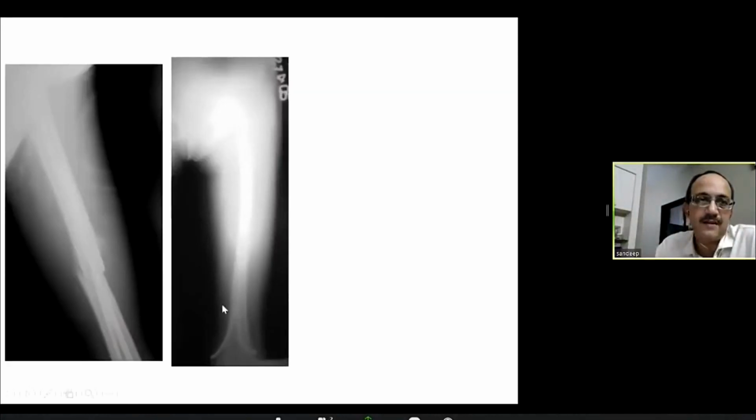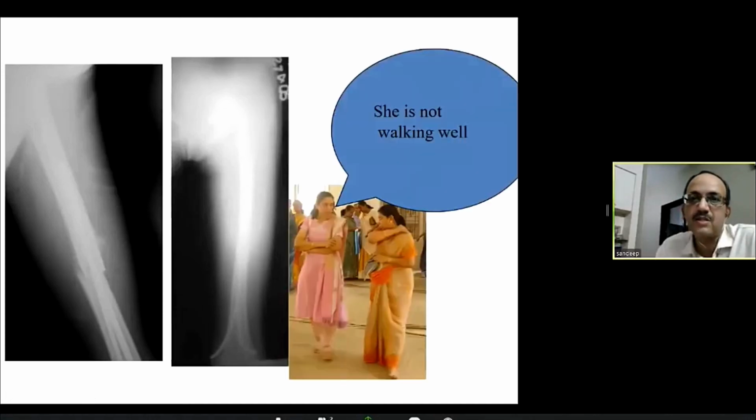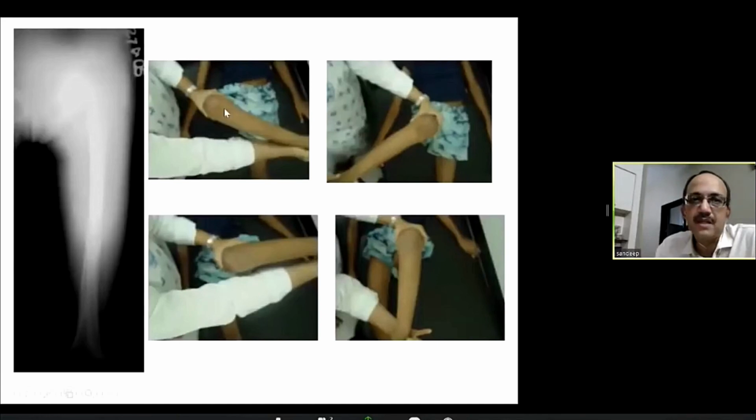Now see this X-ray. A transverse fracture which has been fixed with elastic nails. Satisfactory healing is seen, but the mother says that she is not walking well. She walks crooked. And when you examine the child, you can see this external rotation on this side and on the opposite side where the surgery was done, too much internal rotation and less external rotation.